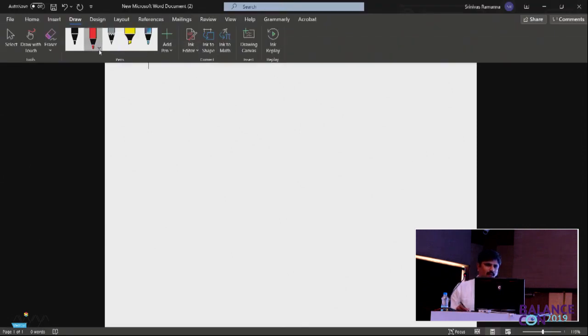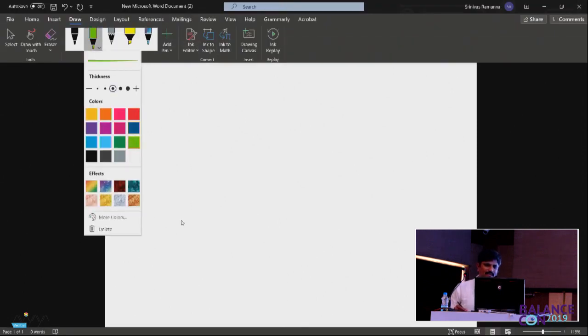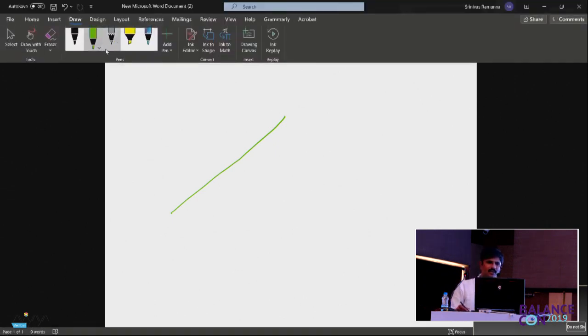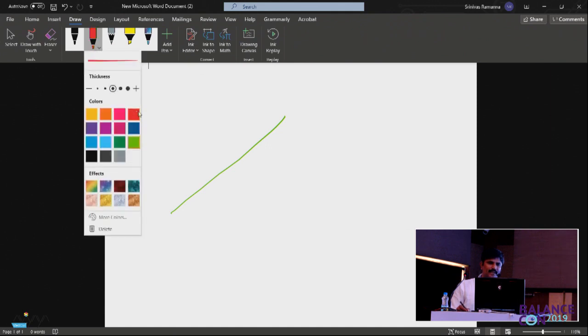Now let us write a trace of the target moving in only one place. Target moving from one side to other side. One part of the smooth pursuit I have taken. The target is moving from the left to the right. Now just imagine there is an individual who is not capable of slow eye movements, this particular kind of slow pursuit eye movements. If he is not capable of slow movements, what will happen? The target is moving, but the eye will stay where it is.